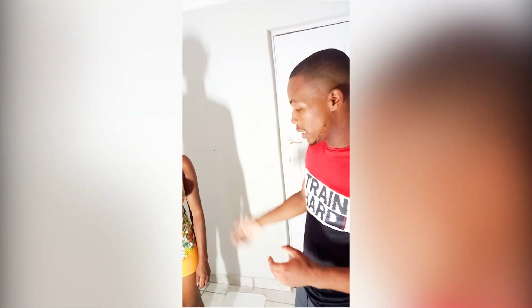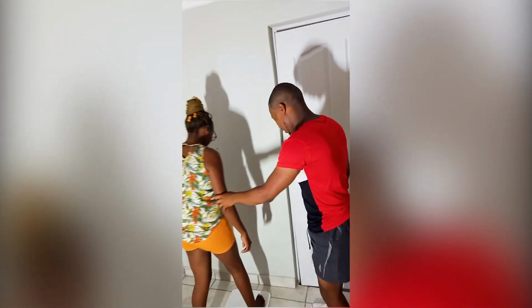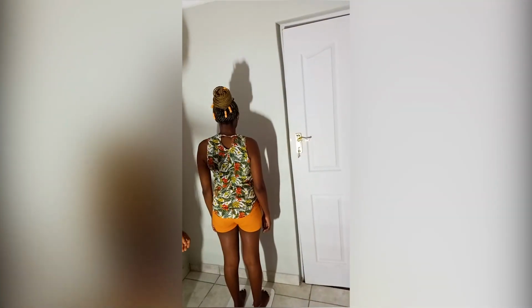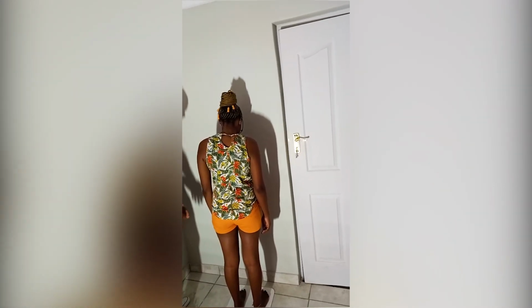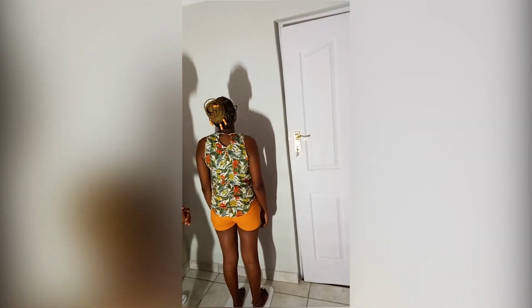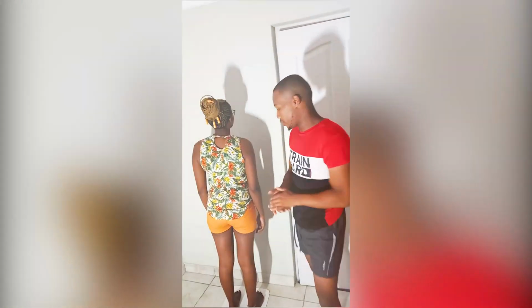For body mass index, I will ask my client to step on the scale and make sure to take off your shoes. Can you please step on the scale? Now we're taking my client's weight. Okay, my client's weight is 57.1 kg. Thank you.